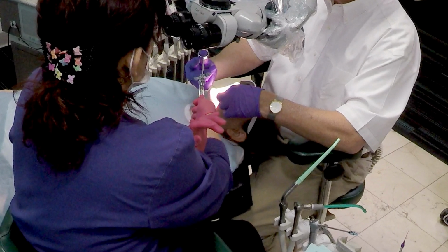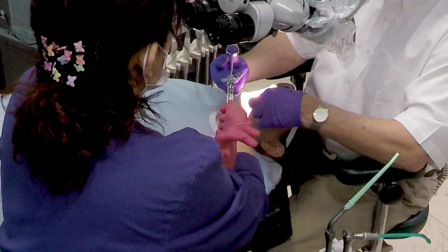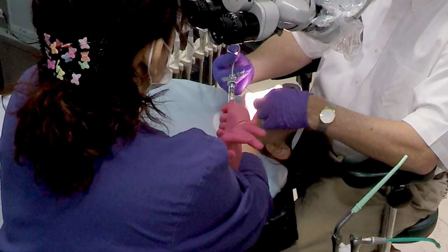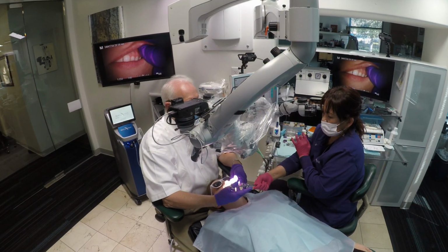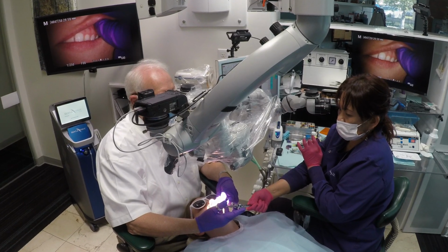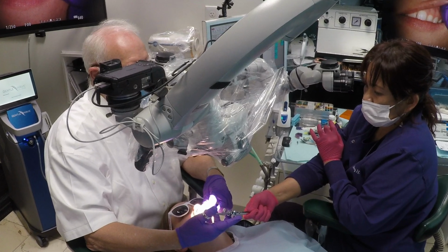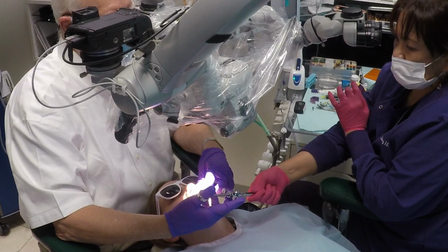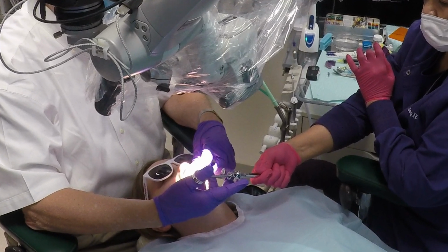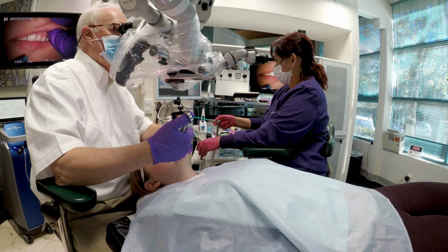can really resolve a lot of the problems in this, because there's a lot of nuances to giving anesthesia, and a lot of people don't do it just because they've never mastered these. So to master them, you need to show these various angles and show the nuances that are really involved in doing this without risk of needle punctures and carelessness.